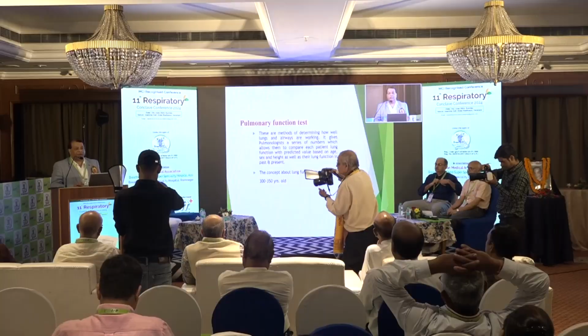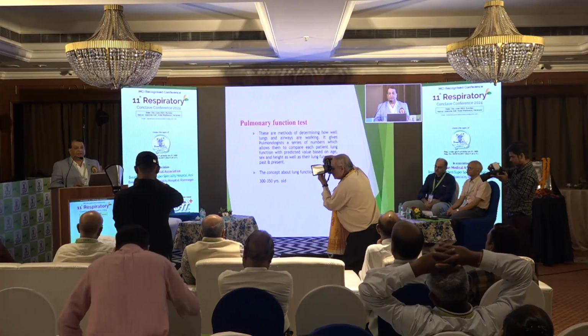As we know, the pulmonary function test is to know the lung function, how it physically works, because the X-ray and CT scan will give the anatomical picture, but the physiological picture will be given by the pulmonary function test. And pulmonary function testing includes many things.